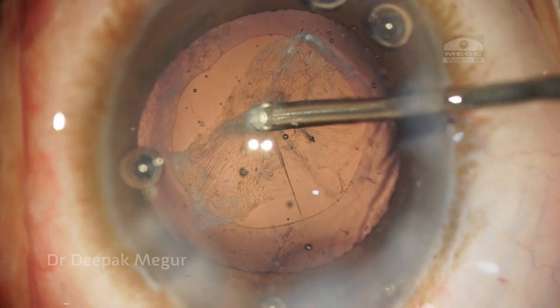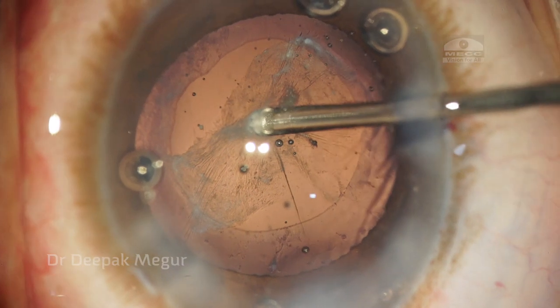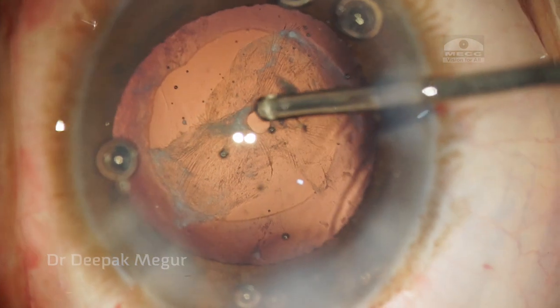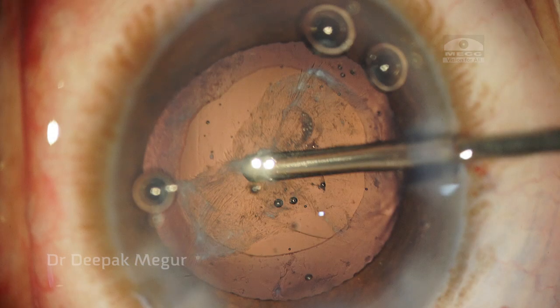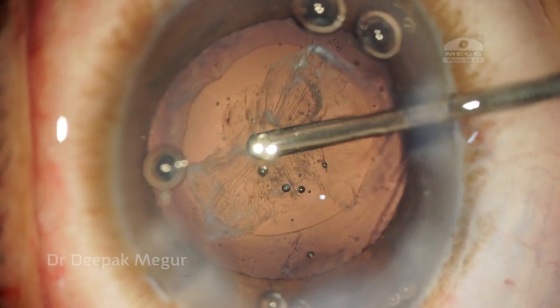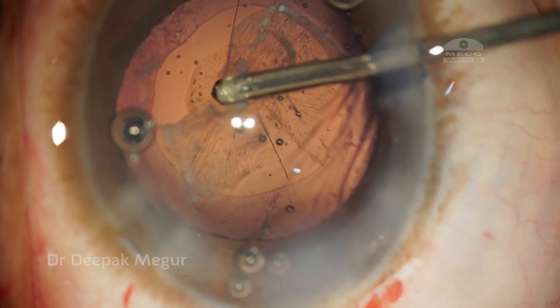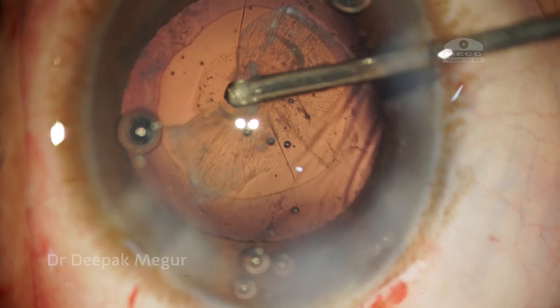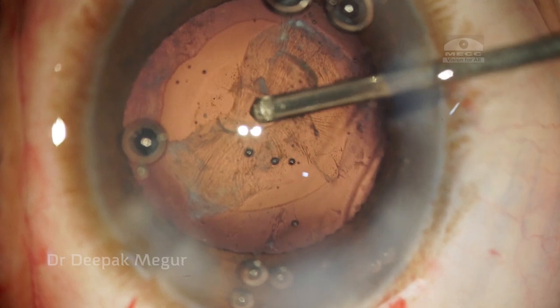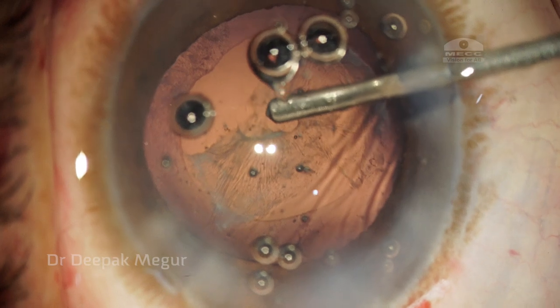The flow rate is extremely low here — just 10 cc — and the vacuum is 300. I am just trying to engage the posterior capsule and make nibbles at it. Care has to be taken that we should not pull or tug at the margins because they can extend in an uncontrolled fashion. These air bubbles are really frustrating — they hamper the visualization.